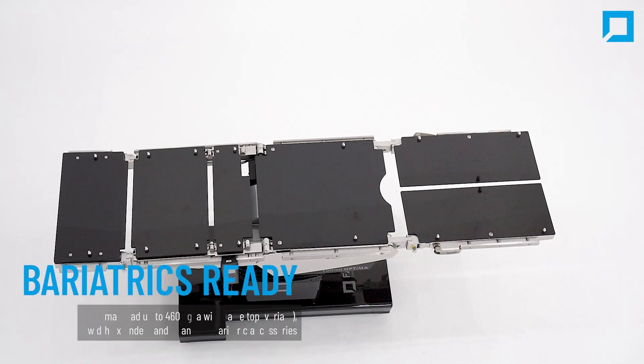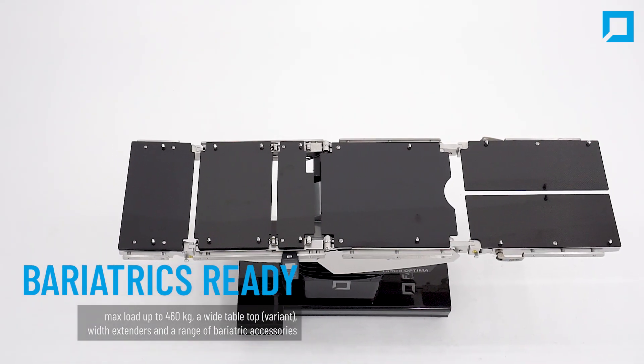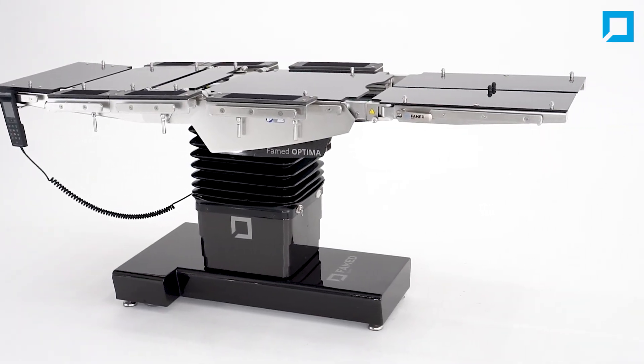With a maximum load of up to 460 kg, a wide tabletop, width extenders, and a range of bariatric accessories, Optima provides the support you need during bariatric interventions.